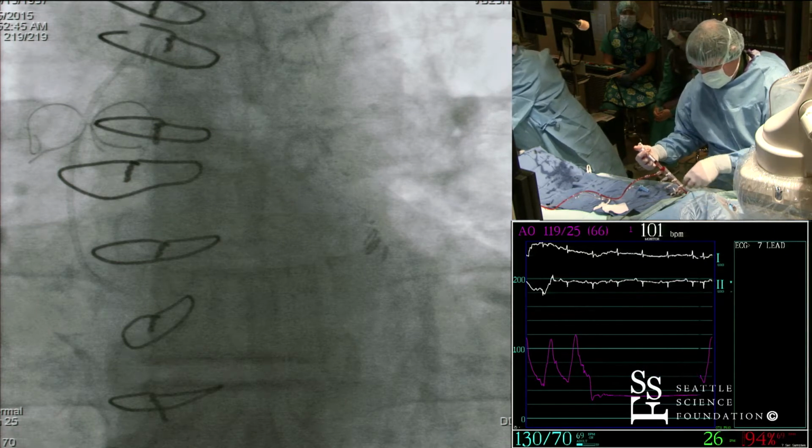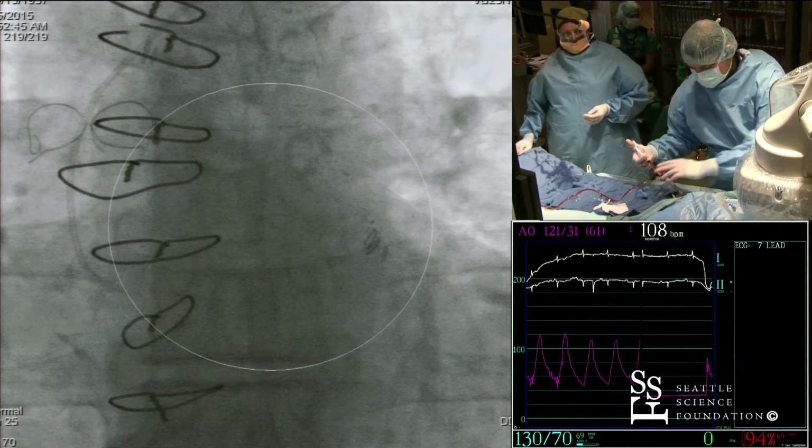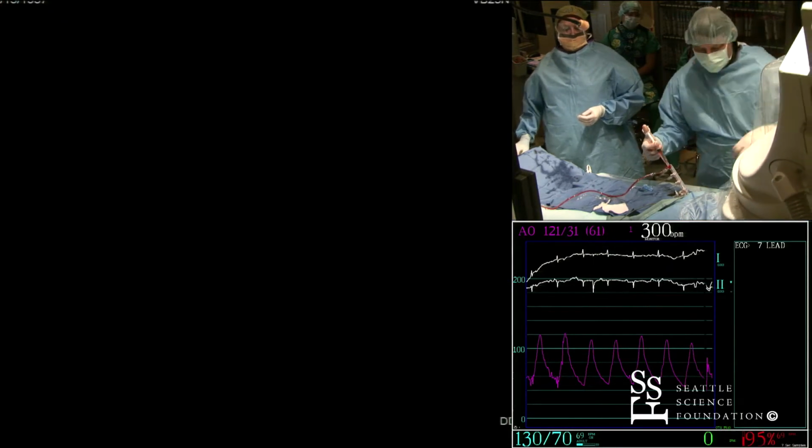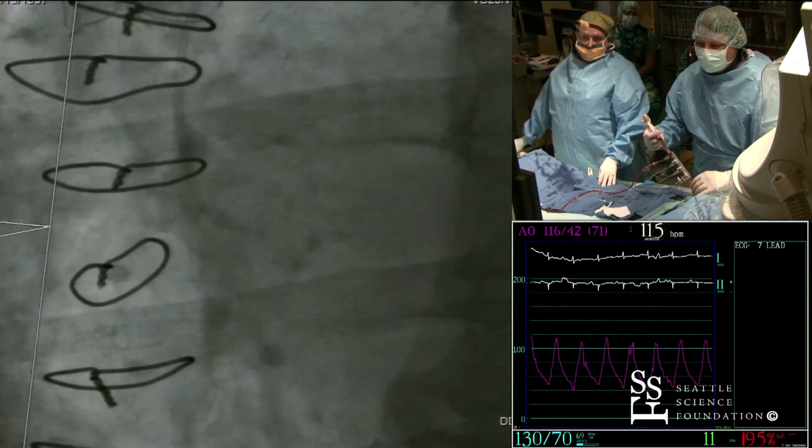So in the initial angiogram, the right coronary was basically a totally occluded vessel. The left is almost subtotal. The LAD had some moderate to severe disease in it, but enough, obviously, that they felt it warranted a bypass operation.